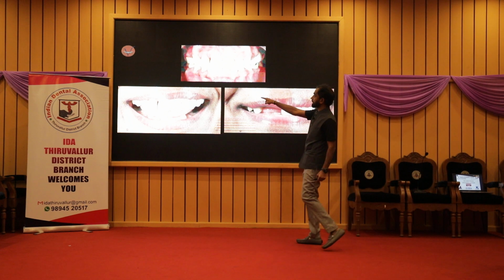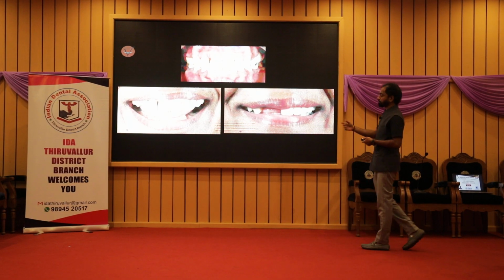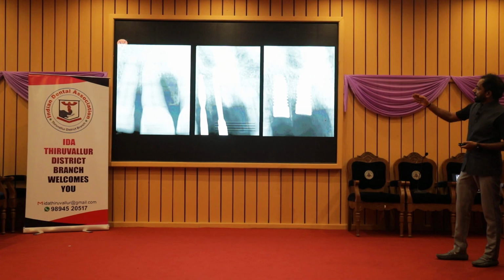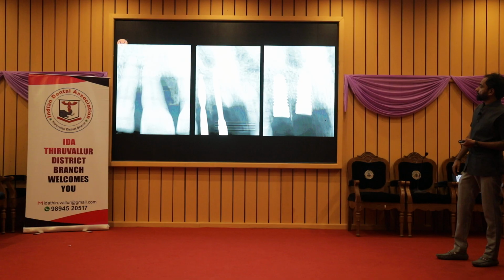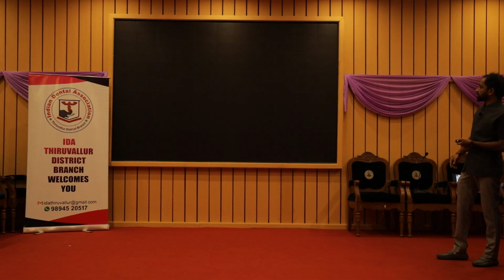This was the patient's clinical picture. I think this is the clinical picture. Then a temporary was given, the six-unit bridge was given. And that is how it was, and that is how the implant was placed. And this is one thing which I didn't like, I'll tell you. That's a molar.